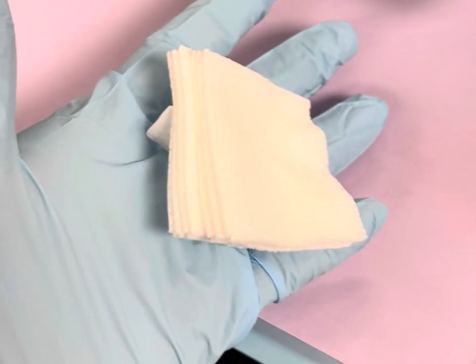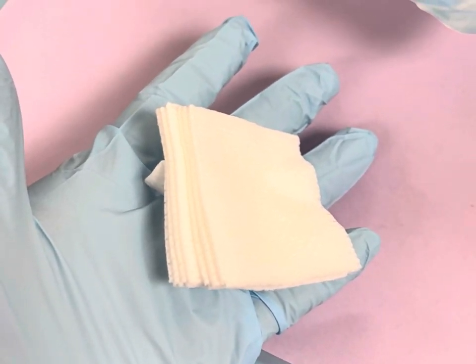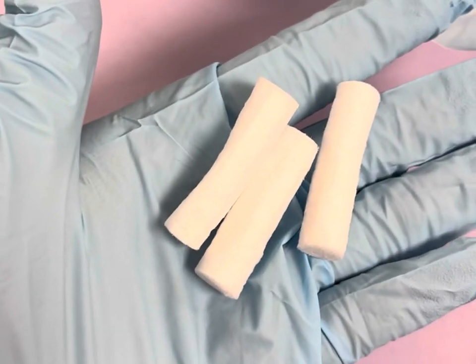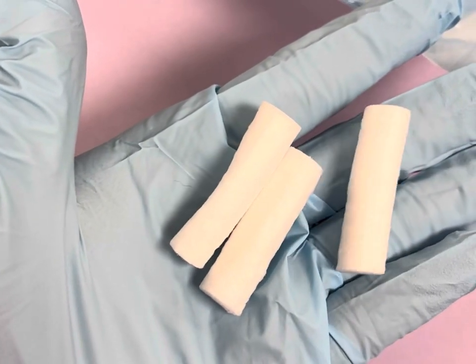These are going to be dental 2x2 gauzes used to help in the preparation. The cotton balls will help keep isolation and help keep the mouth dry.